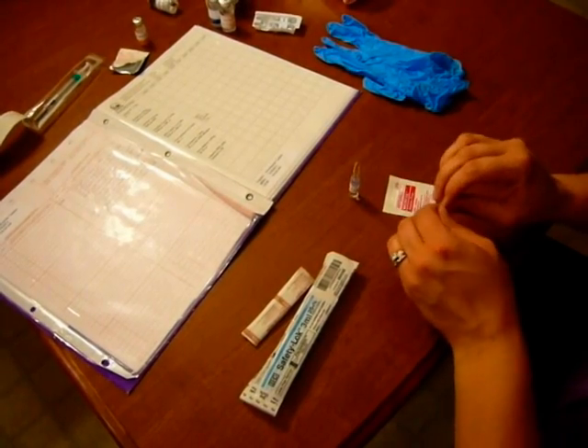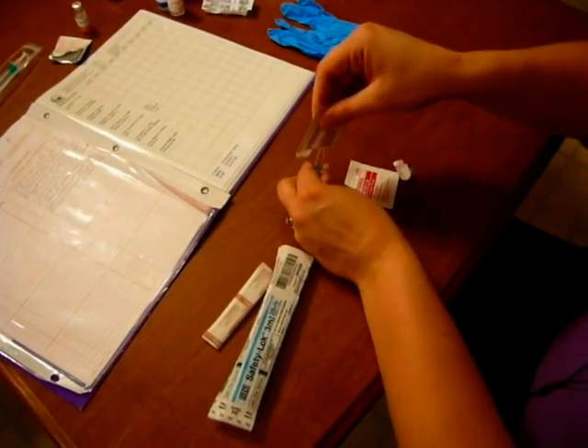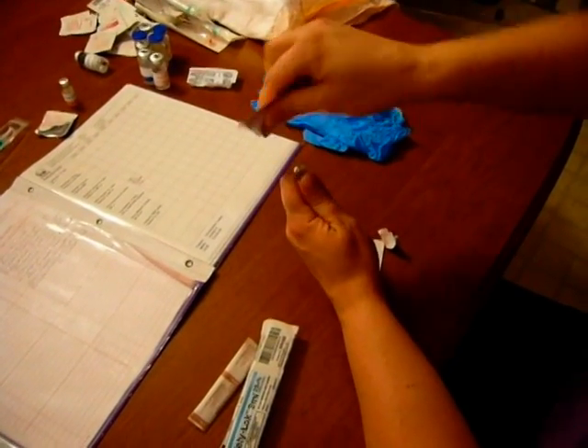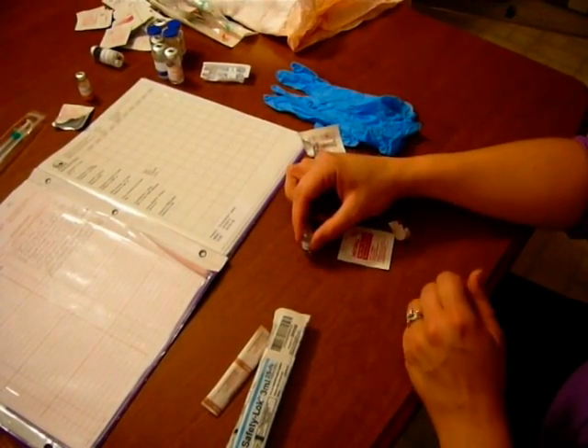The next thing we need to do is break off the head of the ampoule. We're going to do that by ripping off the top of the alcohol wipe, puffing it out a little bit, putting it over the ampoule, putting our thumbs together, and breaking it away from us like that. Now the glass is in there, which will need to go in the sharps container later, so we'll set that on the side. Now my drug is ready.